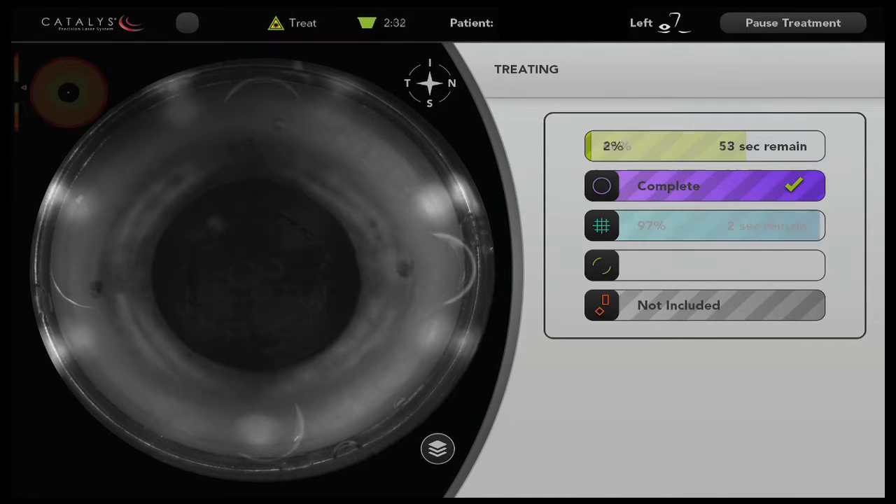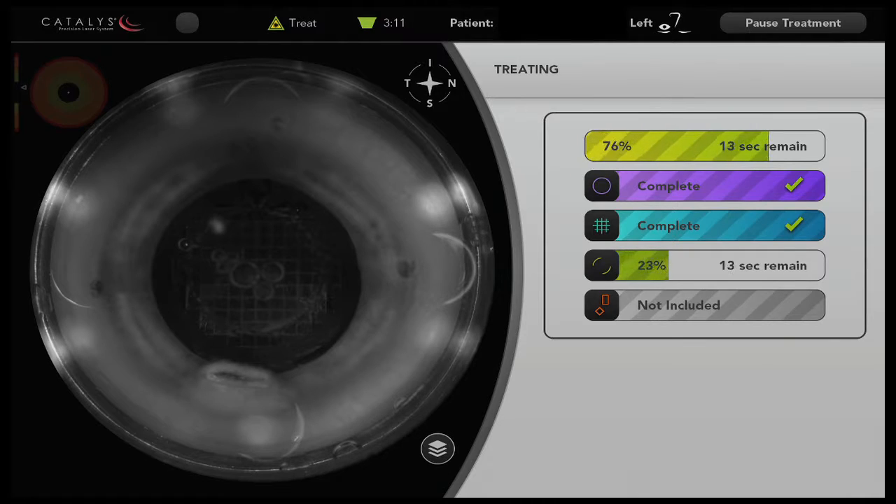One of the things that's been a key element to producing a more accurate orientation of the arcuate incisions for me has been using a new marking pin, and these are readily visible underneath the infrared camera of the Catalyst system.